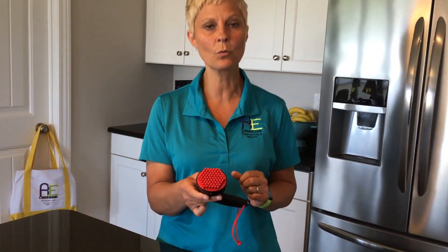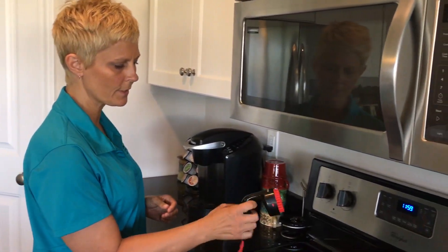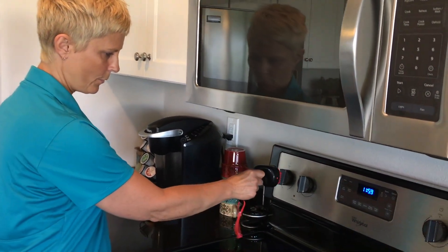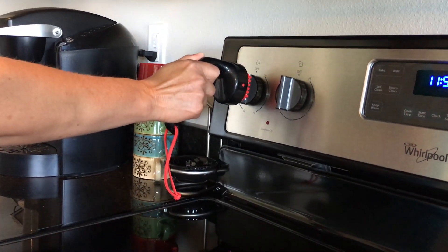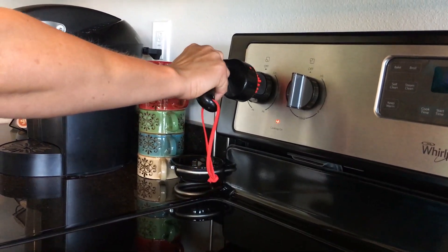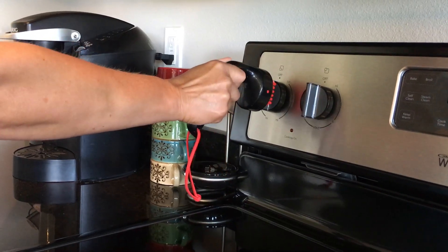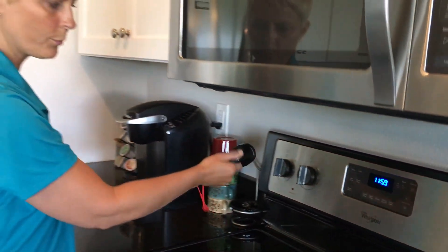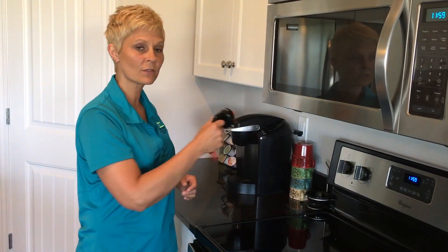We're going to first take a look at how this works on the knob of a stove. I'm just gripping this like a regular handle. I'm going to press it lightly into the stove knob and give it a little bit of a turn. And as you can see, the stove is coming on. Then I'm going to turn it right back off. The pressure that I had to apply to push it is very light, and the turning is very light.